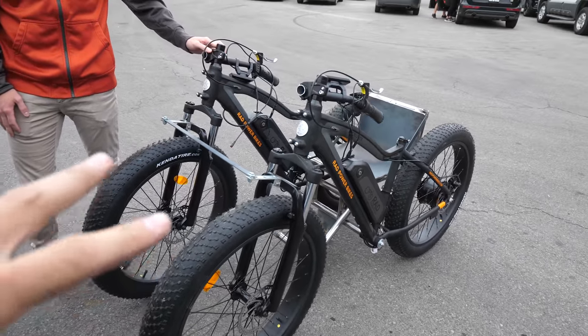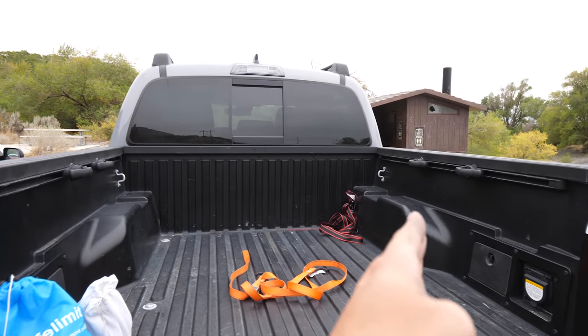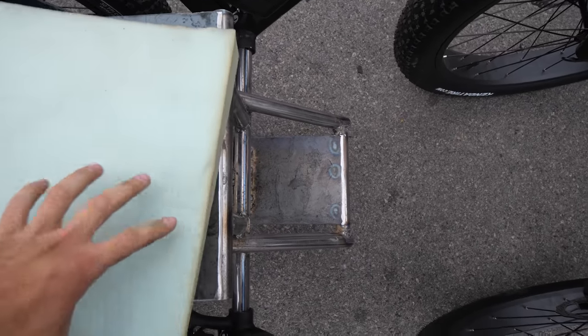One thing I designed specifically was that the wheels are narrower than the wheel wells in my truck, so I can just load the bike into my truck without worrying it won't fit. Both batteries right now are fully charged. We're going to take it on a trail, so it's going to be more of a crawl and less of a speed race.